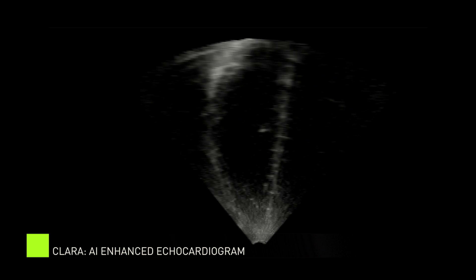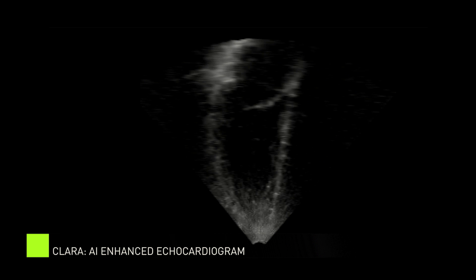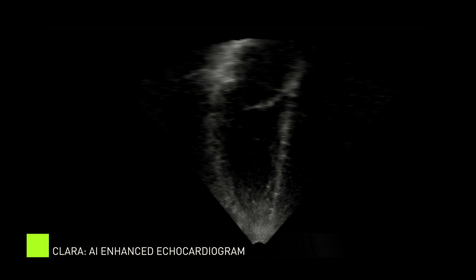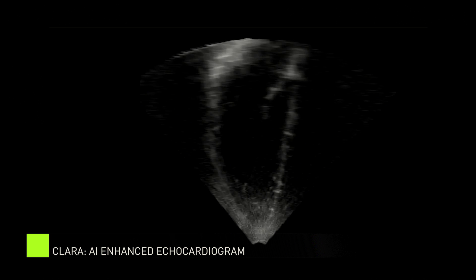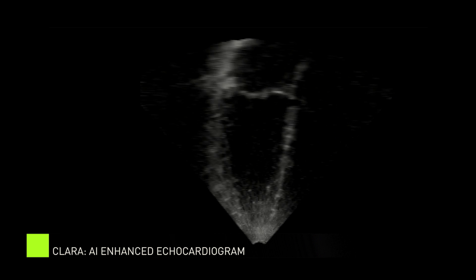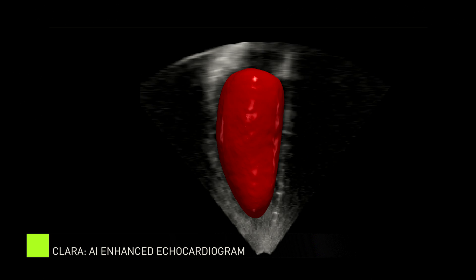This echo shows the left ventricle of the human heart pumping oxygenated blood throughout the body. You can see at the top where the mitral valve in the left ventricle is opening and closing.